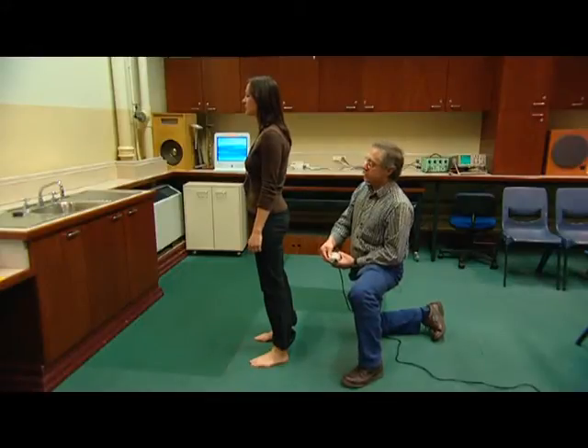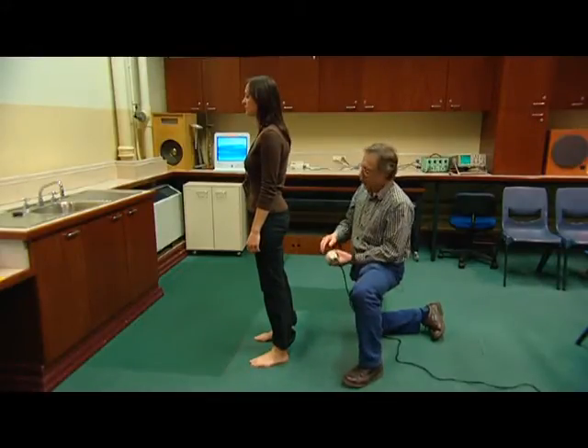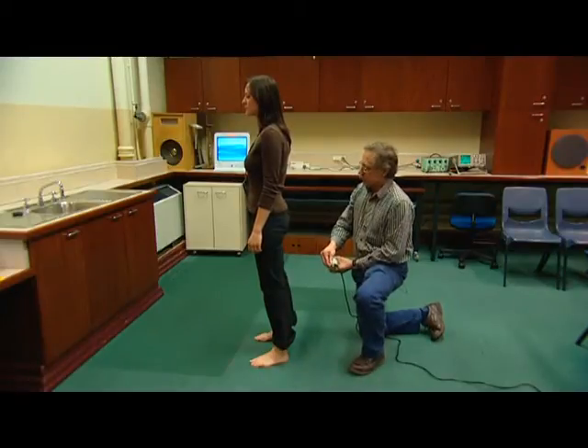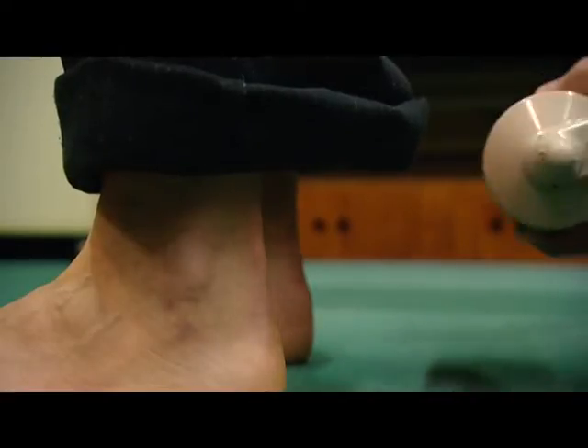I'd like you to close your eyes and relax completely. I'm going to put the massage unit on the tendons of your ankles and we're just going to see what happens.